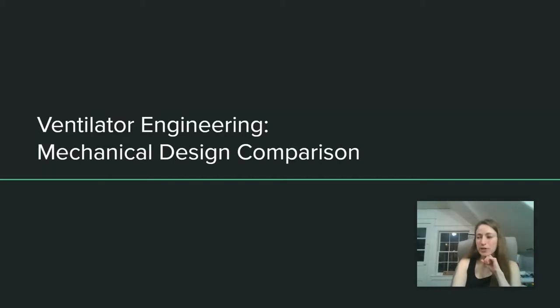I've chosen these projects in particular because they're more developed projects, and also because I've personally spoken to a lot of the people working on these projects, and perhaps I can share some of the insights that I have from being able to talk to these folks.